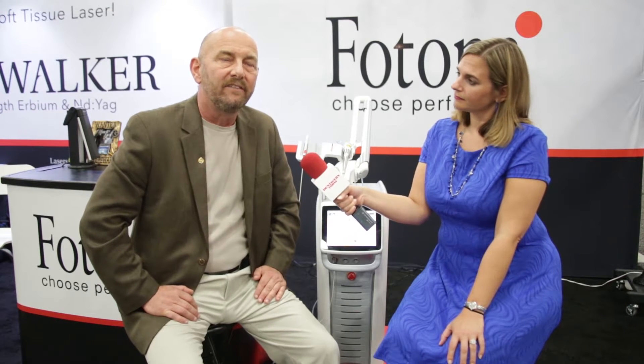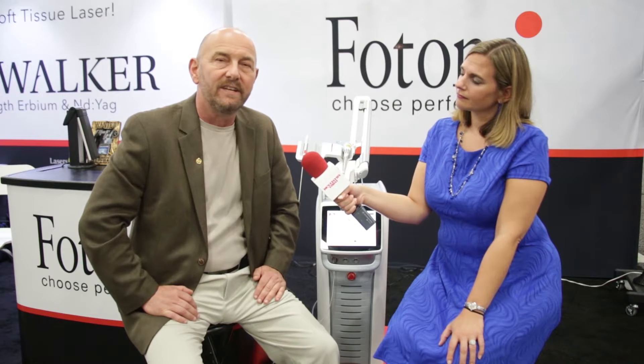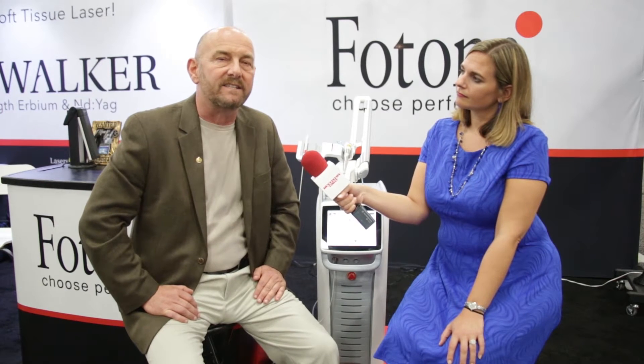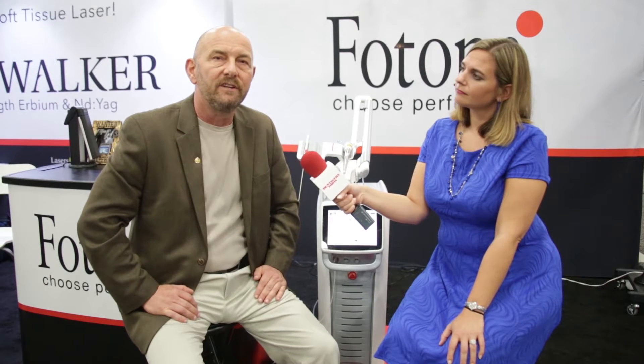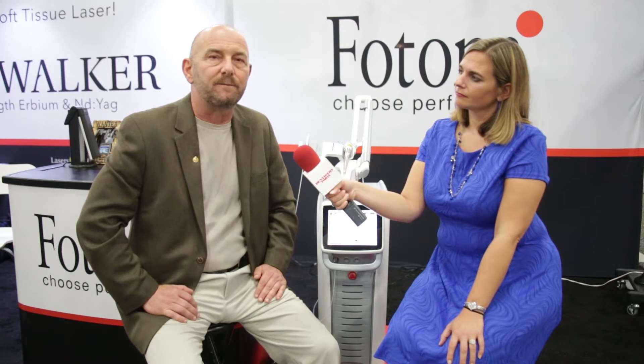The Lightwalker laser — this particular one is the ATS, which is a dual wavelength laser. It has both wavelengths: 1064, which is an ND YAG, and then it has the Erbium YAG laser, which is wonderful for cutting hard tissues. I use it daily in my practice, especially for preparing teeth with children, utilizing the square digital wavelength in this particular unit.